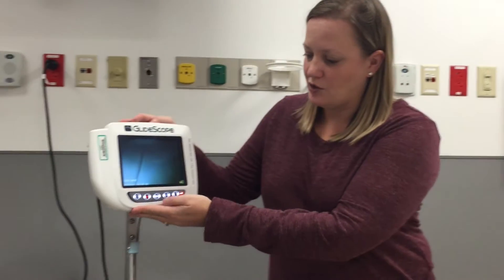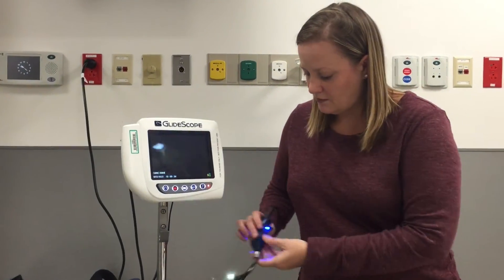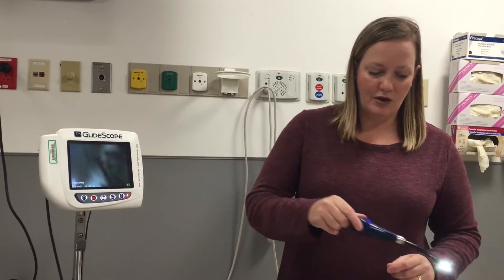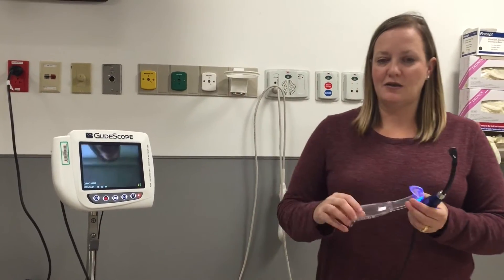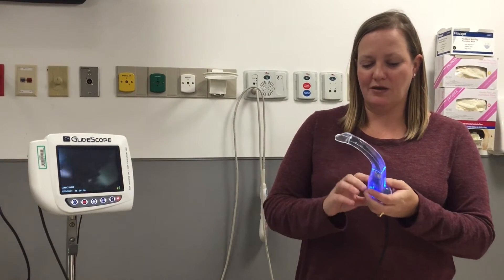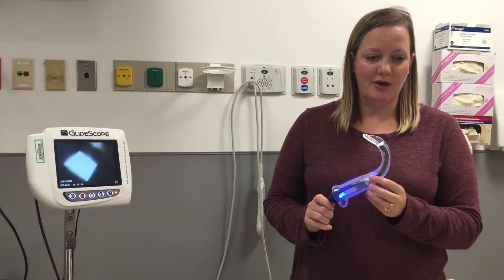You will see that your GlideScope has a screen and the power button is here. This is your camera and this is going to help you see inside the airway. You will place a disposable plastic mechanism over the GlideScope before you place the GlideScope into the patient's mouth.